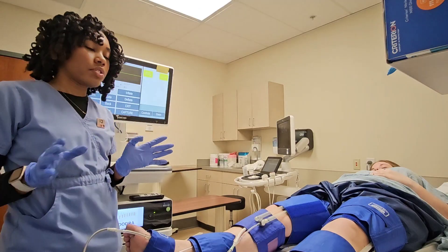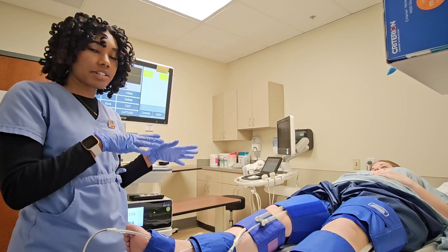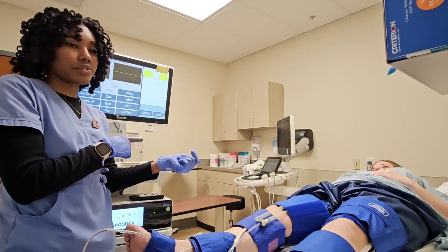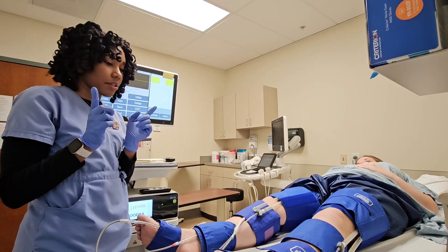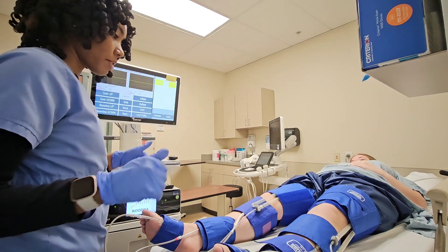Since we usually have nurses take our upper extremity blood pressure, since I work in an outpatient facility, we just put those into the machine for the brachial pressure. But for this video, I'll also show you how to do the upper extremity pressures. For now, let's stick with the lower extremity.